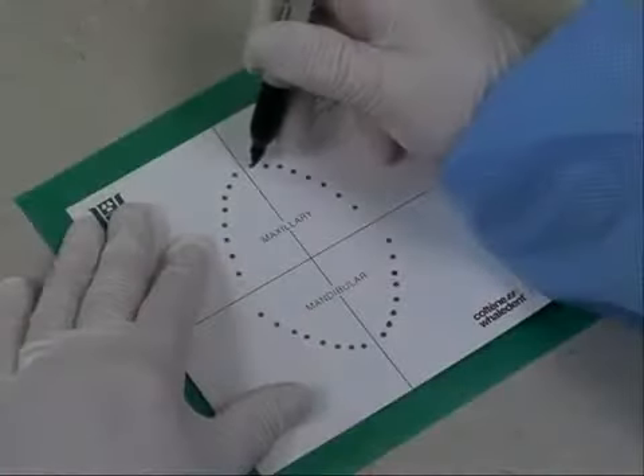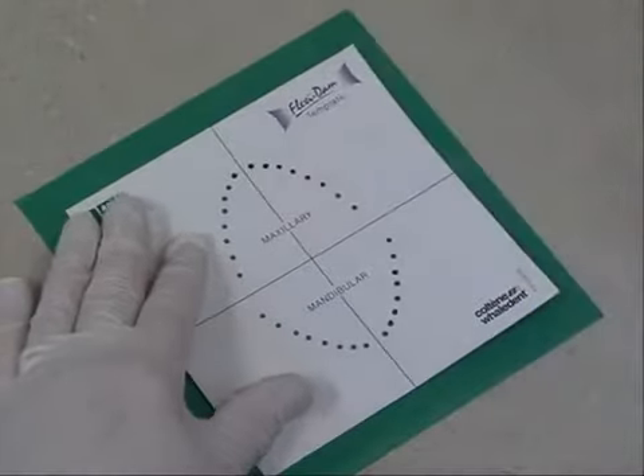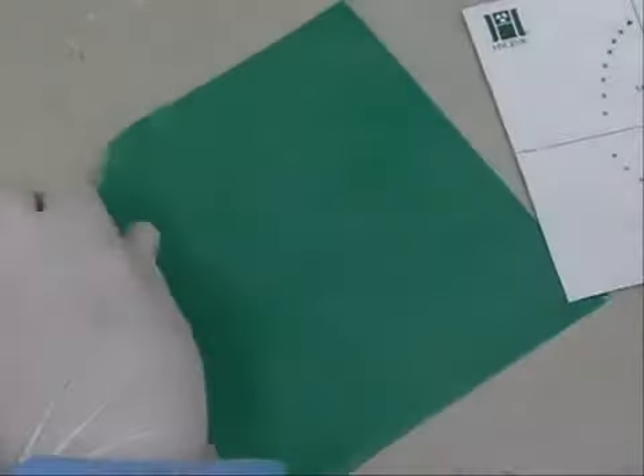For increased access to the working field, the mini-isolation is an alternative method. Mark holes to include three teeth in the isolation with the treatment tooth in the center.